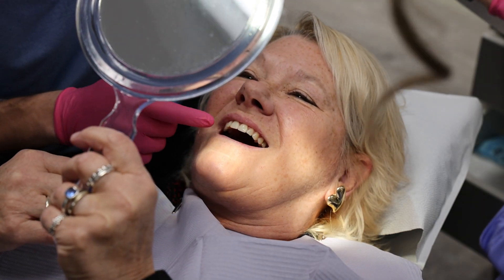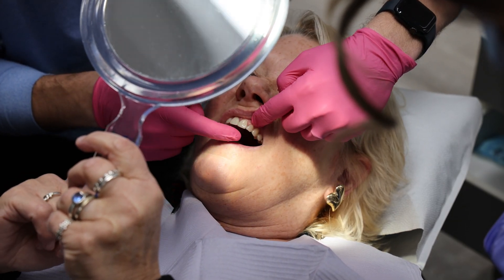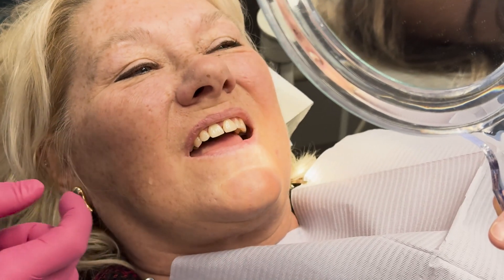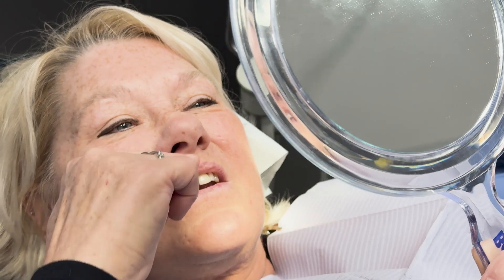This one seems like it swings out a little. This one is up and down right here. Well, it's also moving. That's better. I like it. I don't mind the little bit of space. And like I said, if I made the teeth any wider, they might look a little too unnatural to close that gap all the way. What about the color? I like the color. Good. I look good.